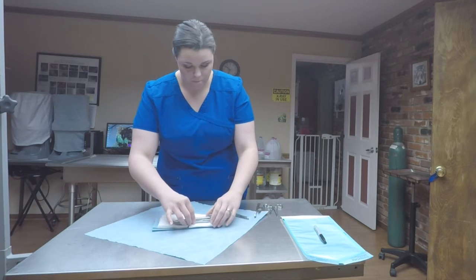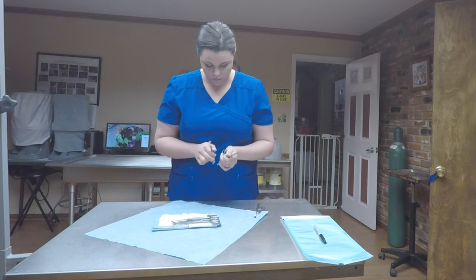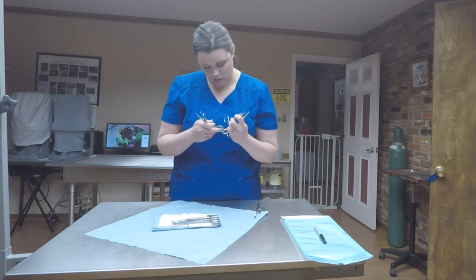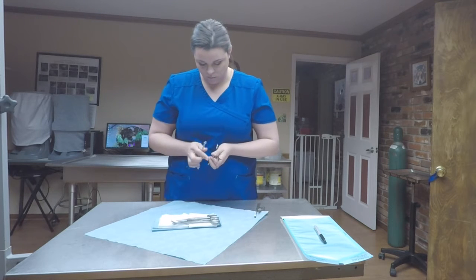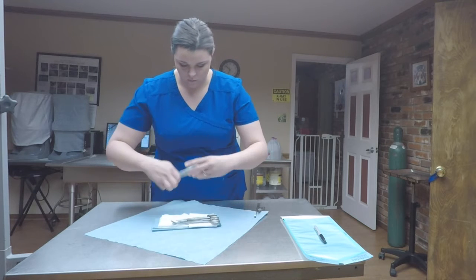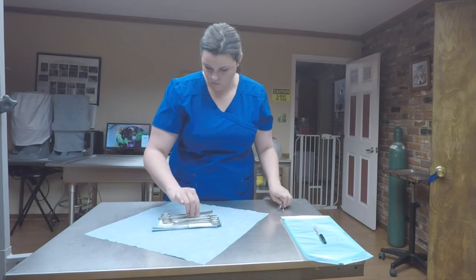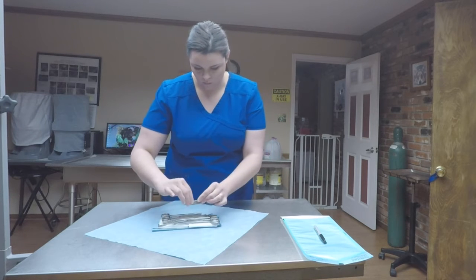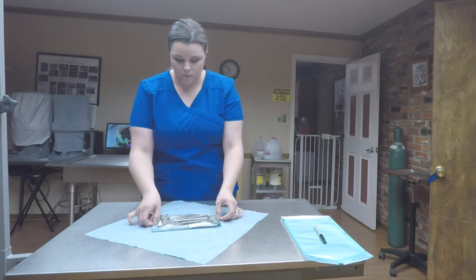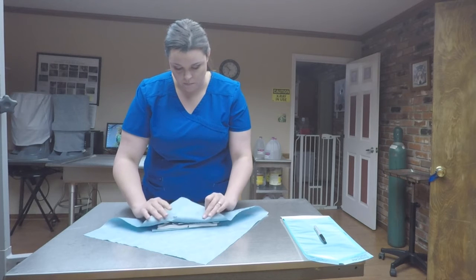And then, what you're going to do is fold the top half like that and then drape backwards.